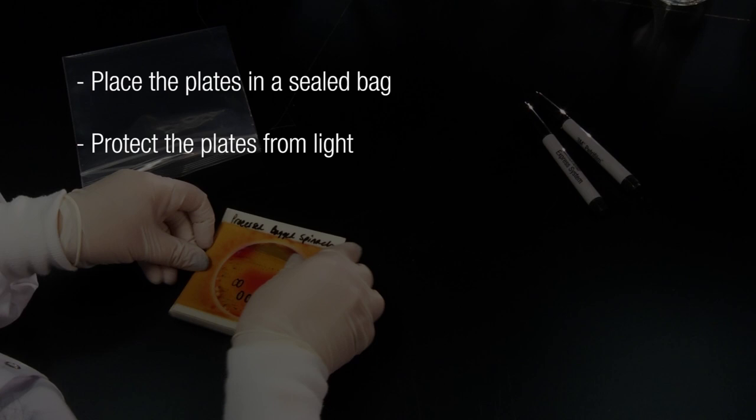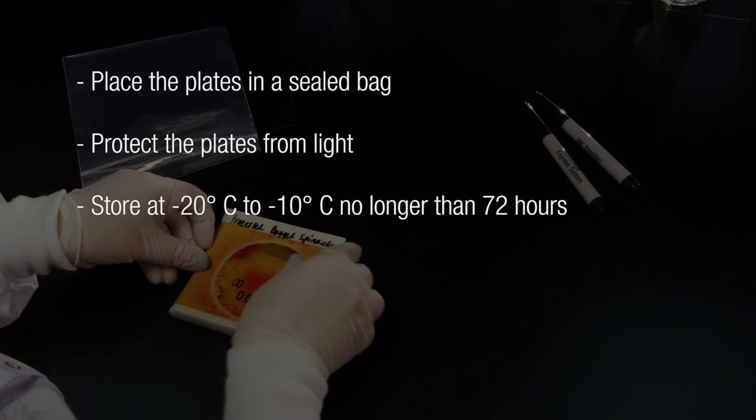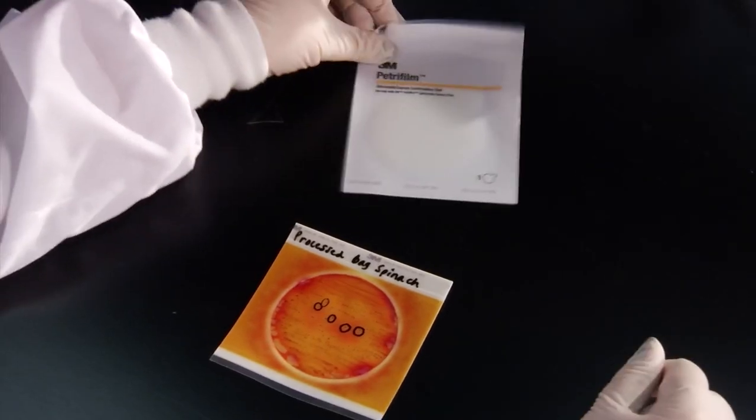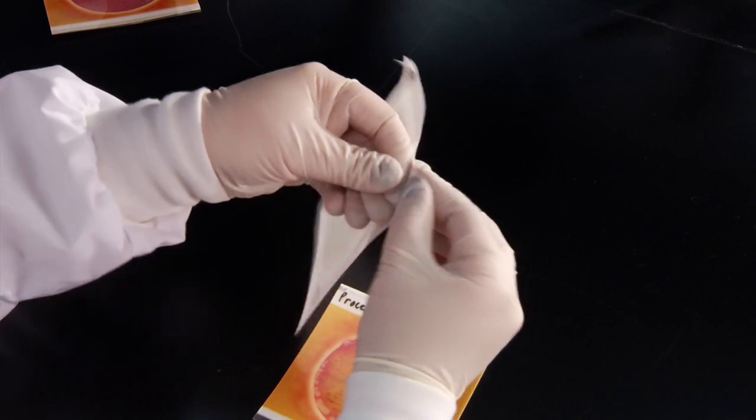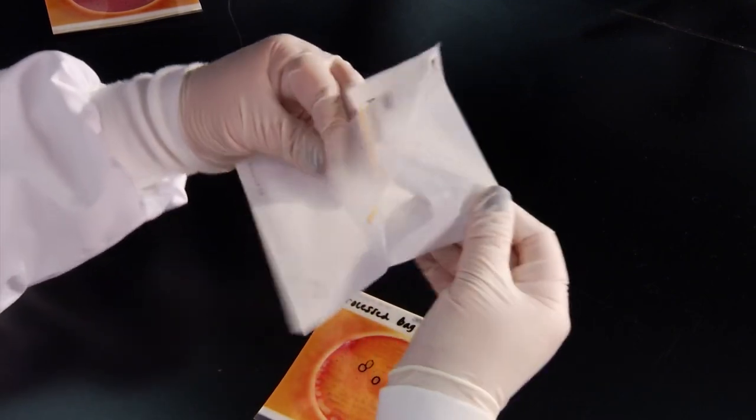Make sure to protect the 3M PetriFilm Salmonella Express plates from light and store the plates at negative 20 to negative 10 degrees Celsius for no longer than 72 hours. Before adding the disc to the plate, allow the plates to warm to 20 to 25 degrees Celsius.